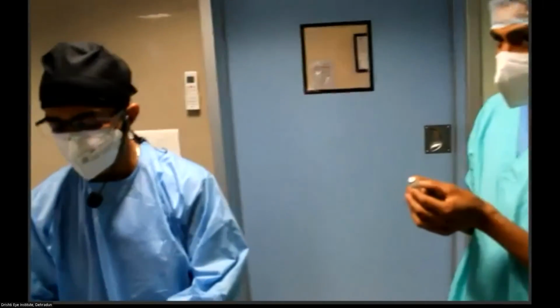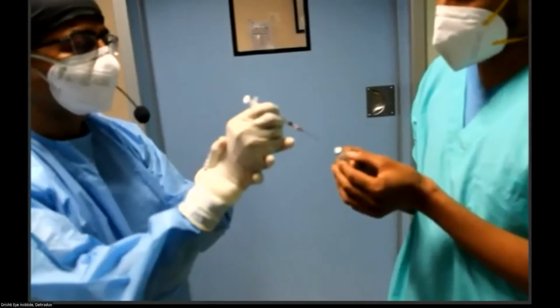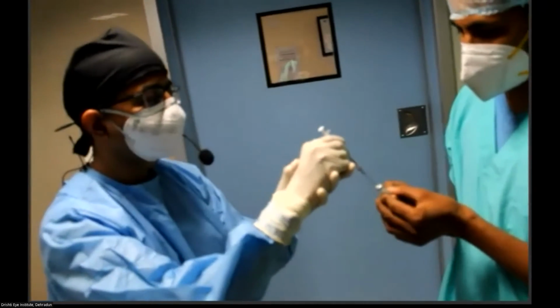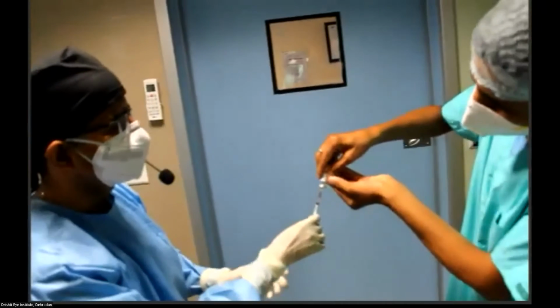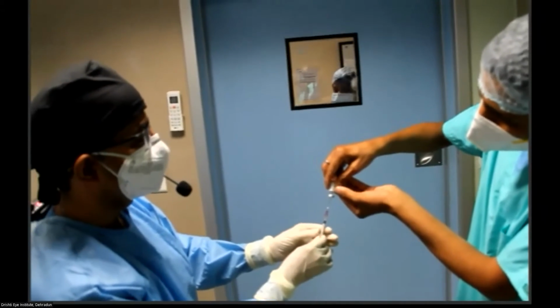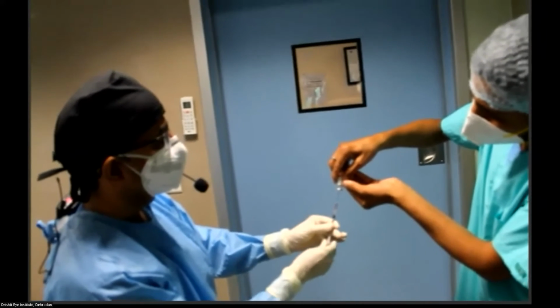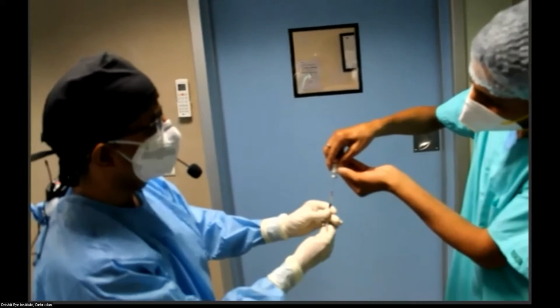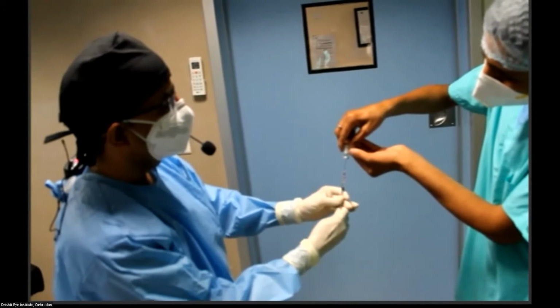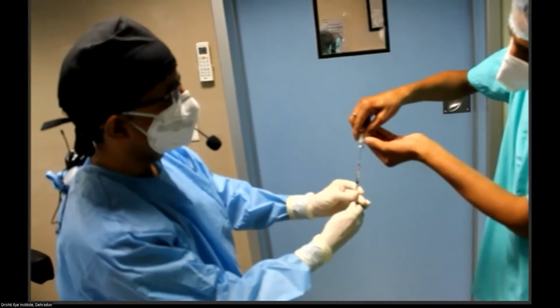And then with the spike on the 1 cc syringe, we pierce the rubber bung right in the center, and then my assistant will hold it inwards so that I can see the level of the injection inside and get the needle inside that fluid or the injection and gradually withdraw the needle as I withdraw the injection into the 1 cc syringe through the spike filter needle.